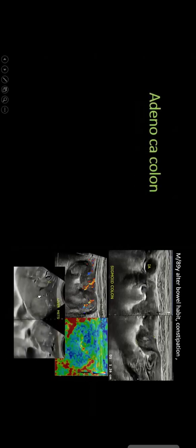The lumen is very much narrowed. Gut signature lost. Hard on elastogram. Definitely short segmental malignancy of the sigmoid. And at the same time, when you examine the patient, there were multiple liver metastatic lesions.